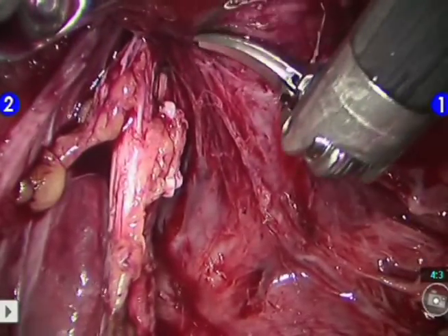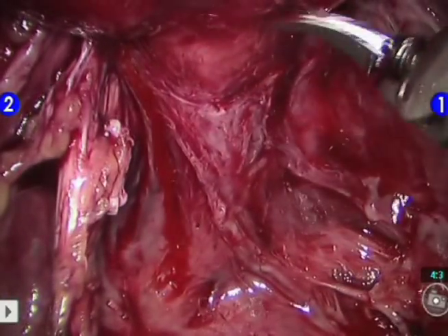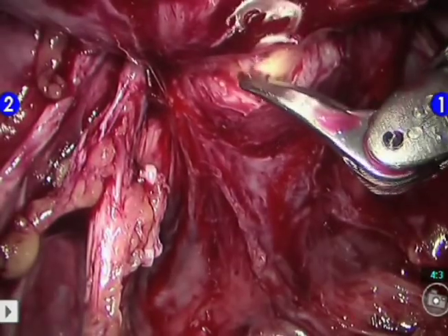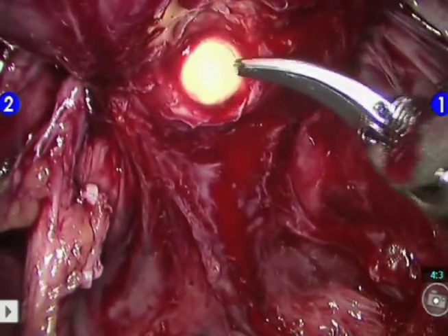Dissection of the superficial layers of Denonvilliers' fascia begins using sharp, curved scissors, exposing the precise prostate-urethral junction. Next, the posterior wall of the urethra is sharply incised 1 mm distal to the apex. The catheter is exposed and withdrawn through the posterior urethral opening.